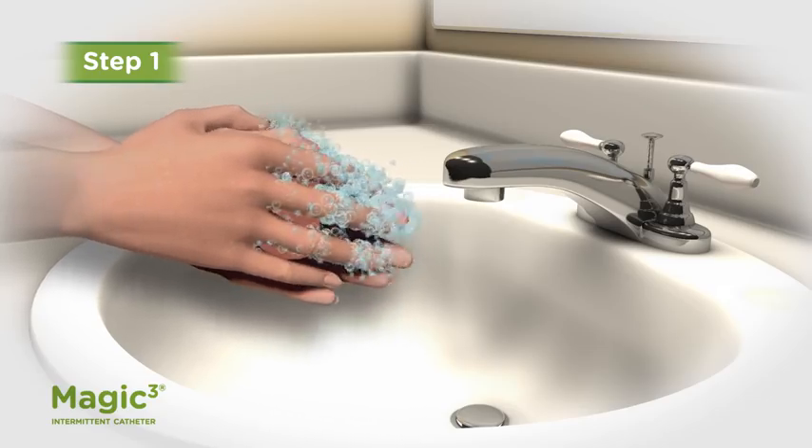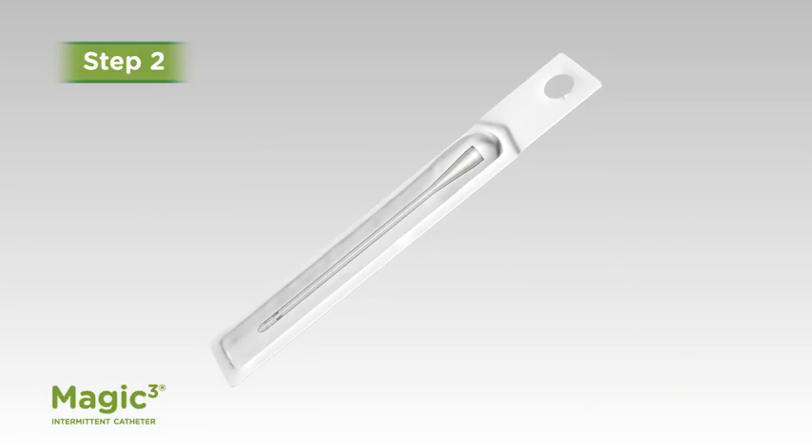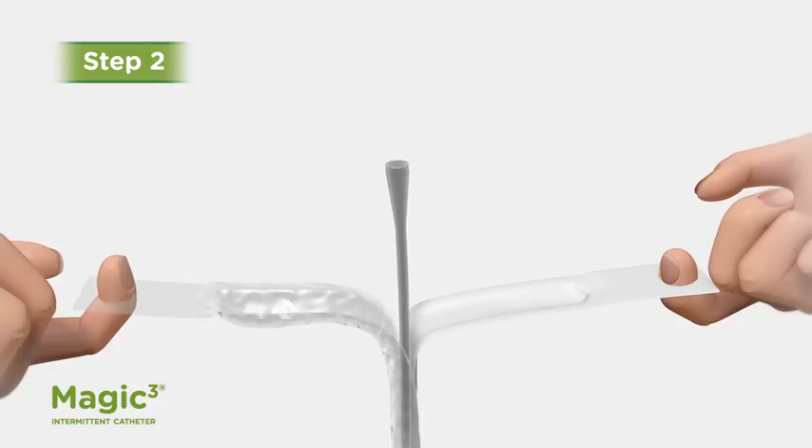Step 1: Wash your hands with soap and water and dry them. Step 2, if using an uncoated catheter: Open the package to expose the entire length of the catheter.